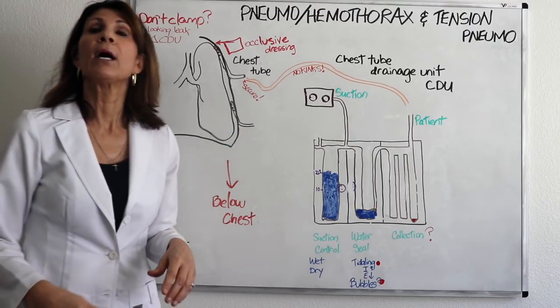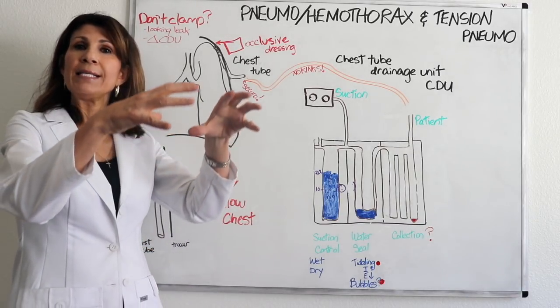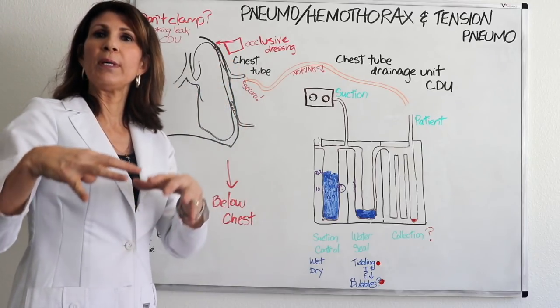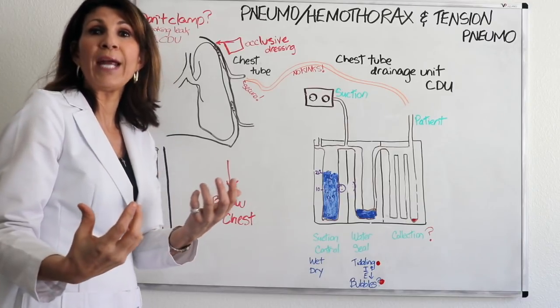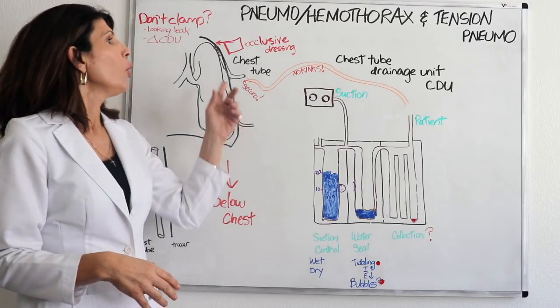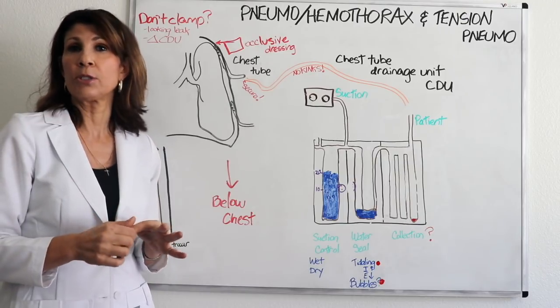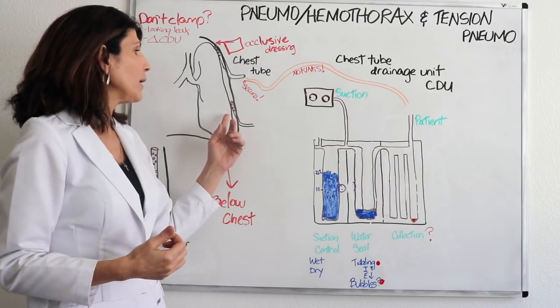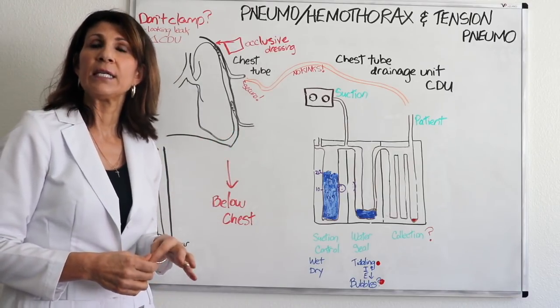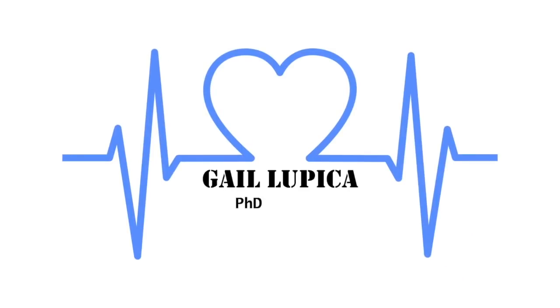Let's talk about where the chest tube is placed. Well, if you're resolving a pneumothorax, which is air in the pleural space, air rises. So if you want to resolve that, you want to put the chest tube in the place where the air is located. Generally speaking, and there are deviations, when you are resolving a pneumothorax, it is put into the second intercostal space. If you're resolving a hemothorax or fluid, then it's between the fifth and sixth intercostal space, mid-axillary line.